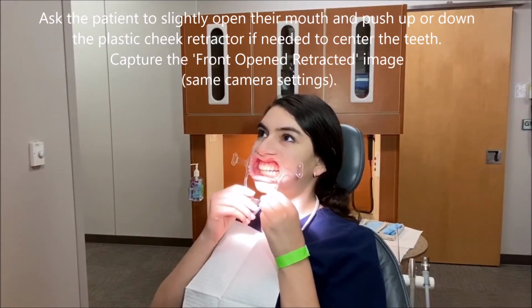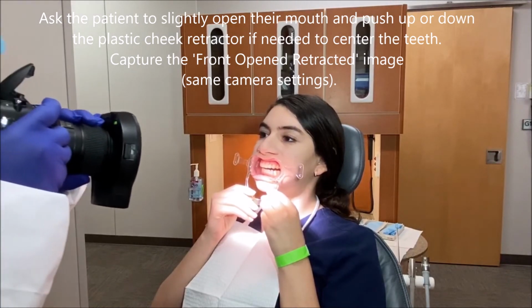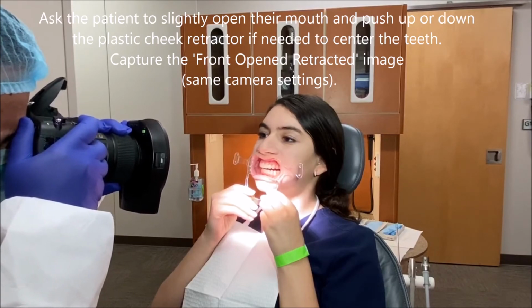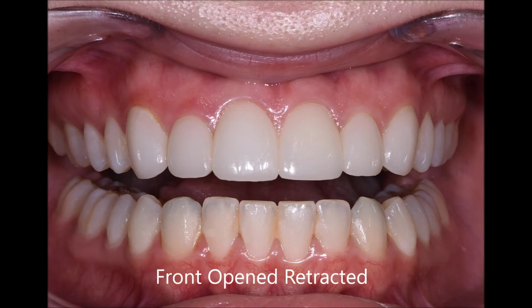Ask the patient to slightly open their mouth and push up or down the plastic cheek retractor if needed to center the teeth. Capture the front open retracted image, same camera settings. Front opened retracted.